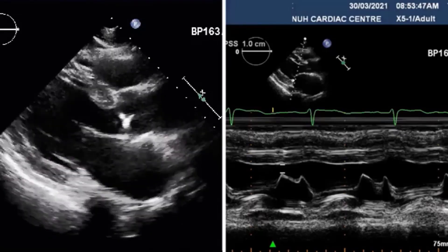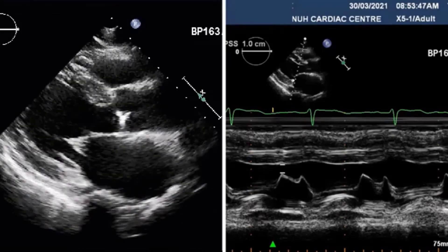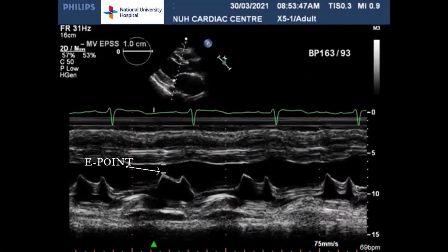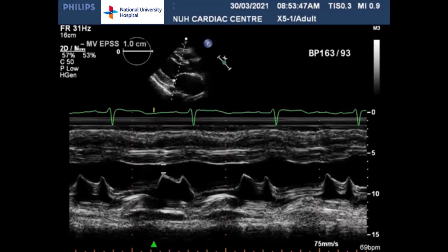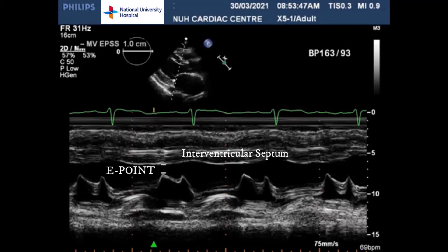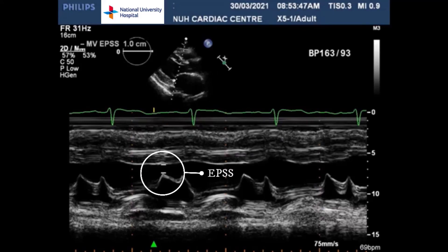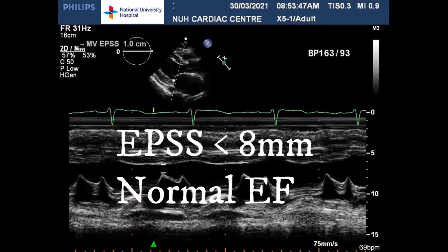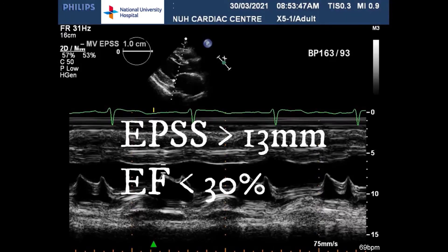The mitral valve waveform on M-mode contains two peaks. The first, larger peak is called the E-point and corresponds to the maximal mitral valve opening in early LV diastole. The second, smaller peak is called the A-point and corresponds to atrial contraction later in LV diastole. The E-point and A-point are labeled above. The distance between the interventricular septum and E-point is used to determine EPSS. EPSS correlates negatively with LV ejection fraction. An EPSS of less than 8 mm indicates normal EF, whilst an EPSS of greater than 13 mm is indicative of EF less than 30%.